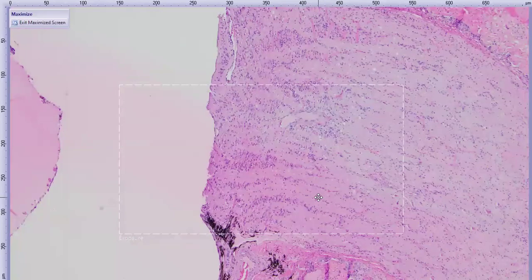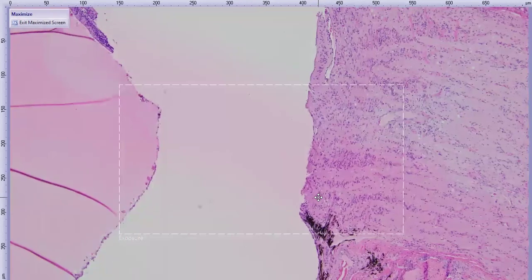If we follow the lamina cribrosa, which are these extensions of the choroid or the sclera here, it's a little bit folded backwards. It should be at the same level as the choroid and the sclera. If you turn your imagination on, you can make the case that it's a little bit backward going, but it's not that impressive.